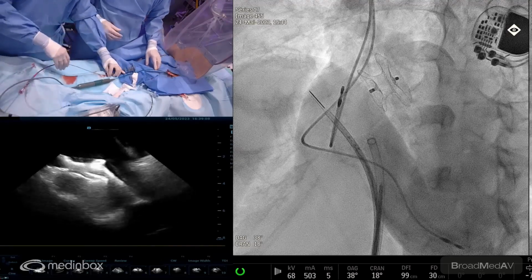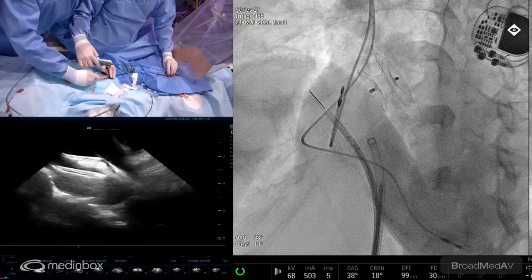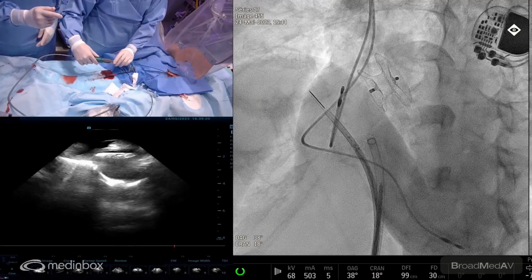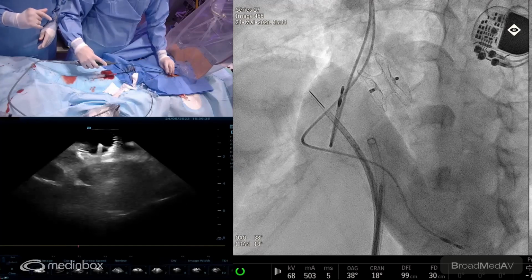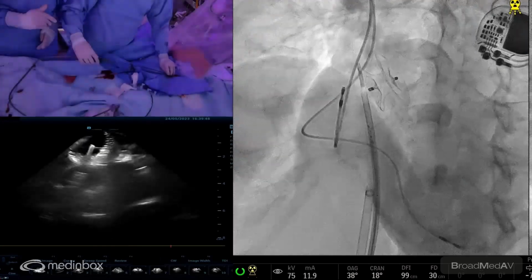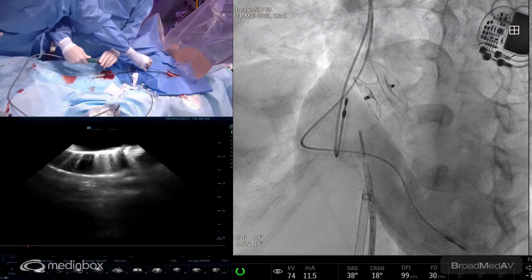It was really stable. And can you see the superior part of the septum, Marcel, is perfect. Can you potentially try to show the other part of the septum? Let's try. It's not easy in this case. Looks beautiful. And now we see the other part of the septum in between the two discs. That's an unusual view, kind of. Good thing we did not touch the pacemaker lead. Yeah, the aorta gets in the way. And it seems difficult and challenging to find a good short axis view. Yeah, I'm too far. So come back and try to go under maybe the device, just to show the device from below.